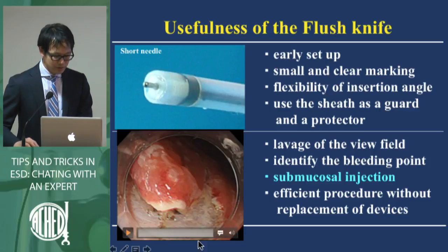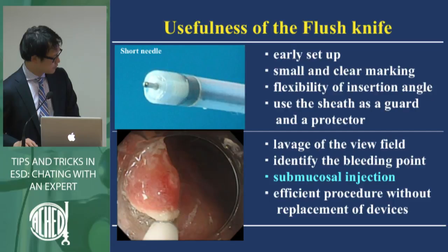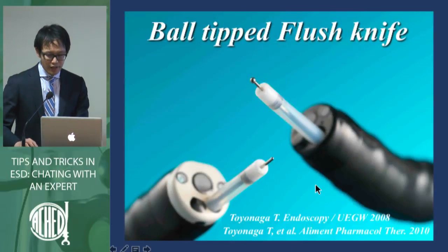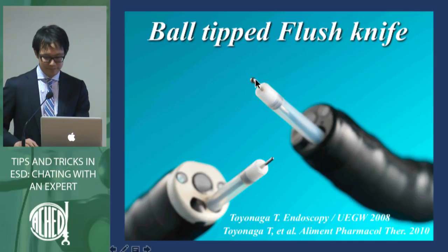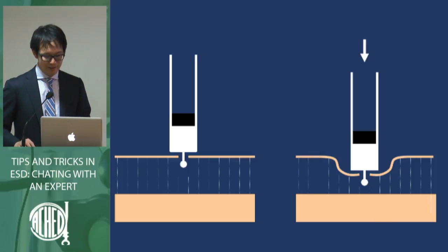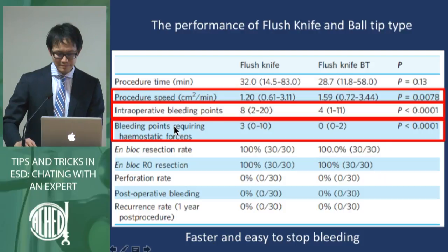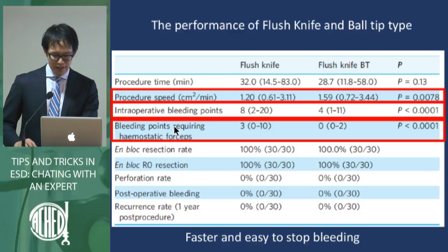So you can see the videos. If you inject with the needle, the submucosal layer is elevated, so it is easier to cut the submucosal layer. And in 2008, the flush knife had a ball tip attached, a 0.9 millimeter ball on the tip. This ball gave it a new ability, easy to scoop up the object. With a ball tip, it can scoop up. The flush knife ball tip improved the procedure speed and the hemostatic effect in clinical studies.